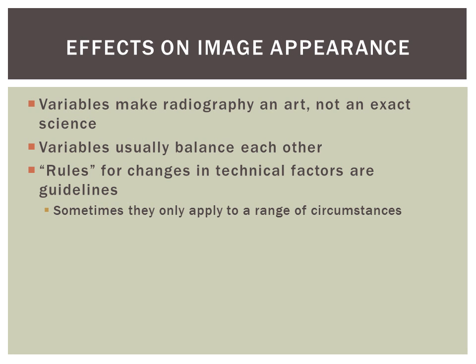Effects on image appearance. Variables make radiography an art, not an exact science. Factors can affect outcomes. Fortunately, variables usually balance out each other. Rules for changes in technical factors are guidelines. Sometimes they only apply to a range of circumstances.